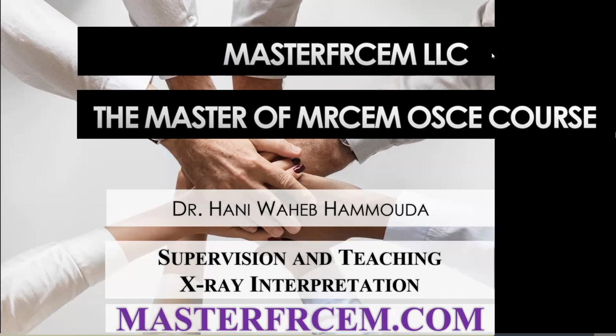Okay, guys. Inshallah, we'll start X-ray interpretation. They will give you in the exam the most common. Is it mandatory to find X-ray interpretation in the exam? No, not common. Don't worry. But anyway, it's a very easy, very short station, very interesting, and I'm sure we are using it every day in practice, but we are not using it for teaching in practice. That's why.